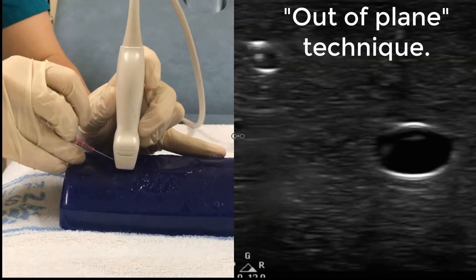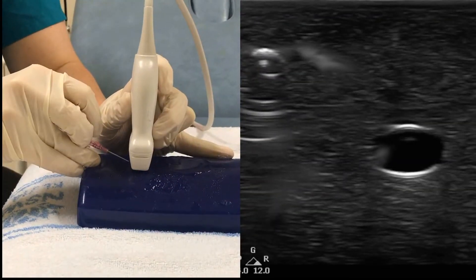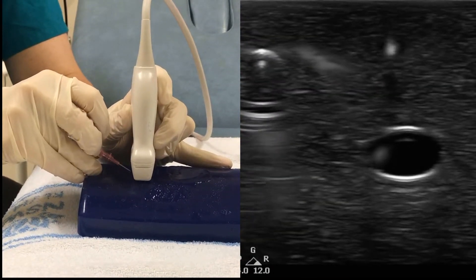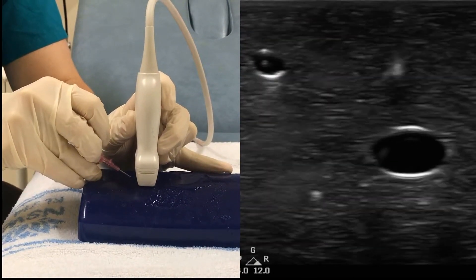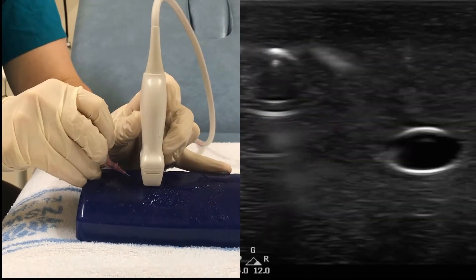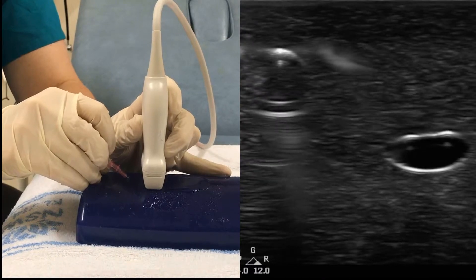Here the out-of-plane technique is shown. The beam is perpendicular to the vein in the transverse plane. Remember to start the cannula insertion slightly away from the probe. Now you can see the sharp metal cannula stylet approaching the vein, indenting its wall and finally entering it. A top tip: keep an eye on the cannula tip by gently sliding the probe to follow it.